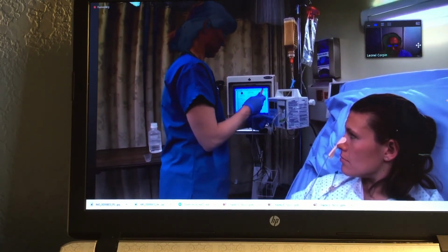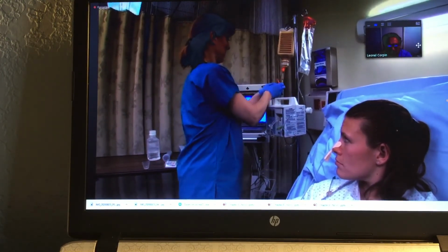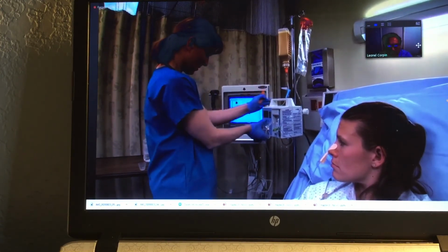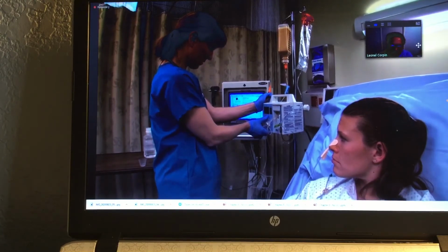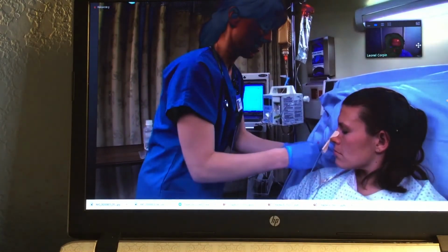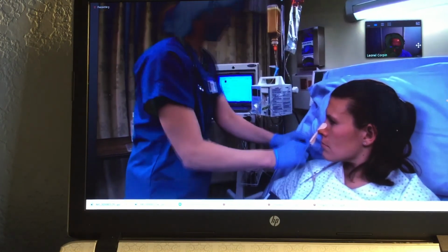To begin the feeding, connect the distal end of the tubing to the proximal end of the feeding tube. Connect the tubing through the infusion pump and set the rate. Make sure the roller clamp is open and all connections are secure. Then start the infusion.